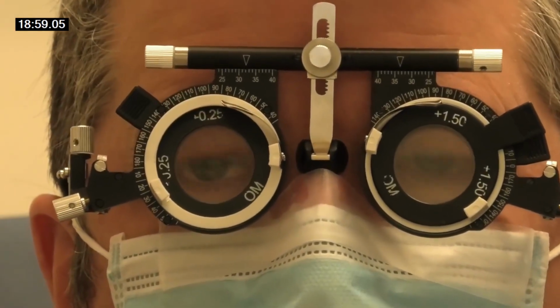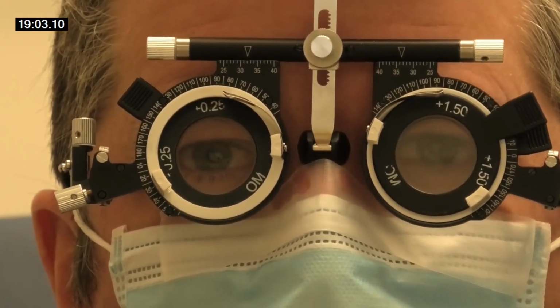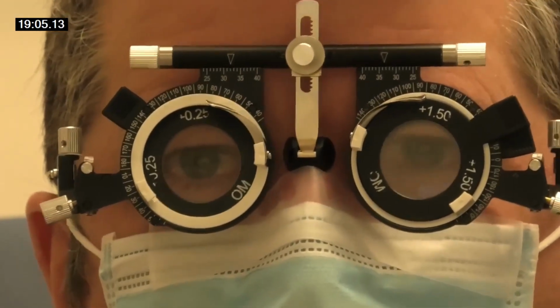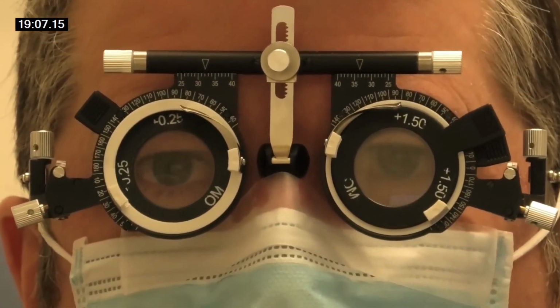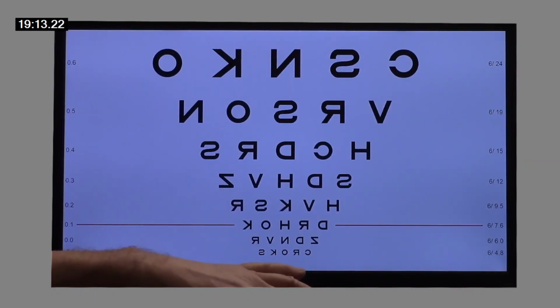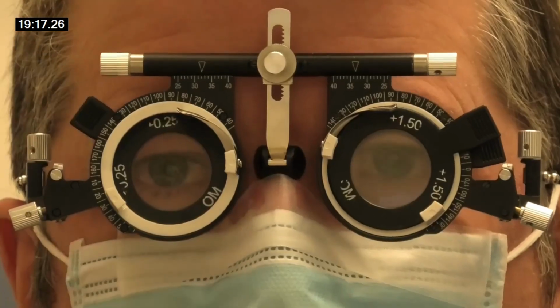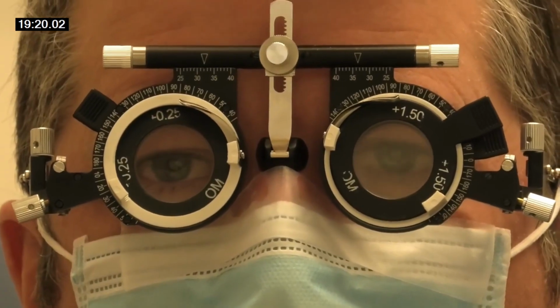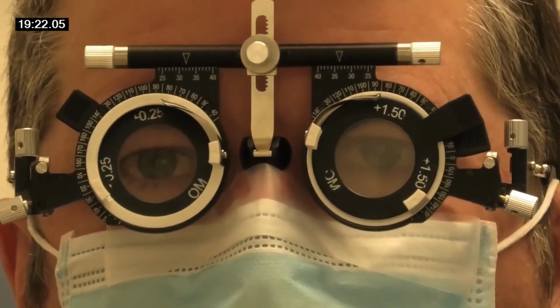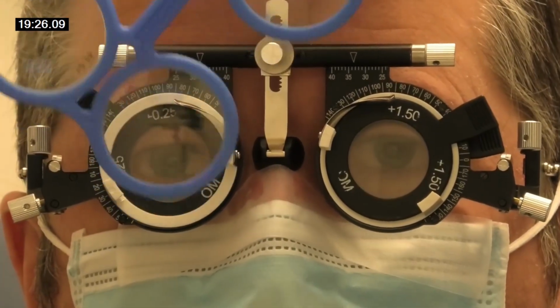What line can you read now? Both eyes or which? Yeah. Okay, so I can read the bottom one. CROKS. Obviously it's blurred. It's got a funny feeling because this way's a bit blurred, isn't it? Yeah. You've got to sort of look through that, you've got to sort of overcome that. So if you look at that S over there, is it clearer with this lens?